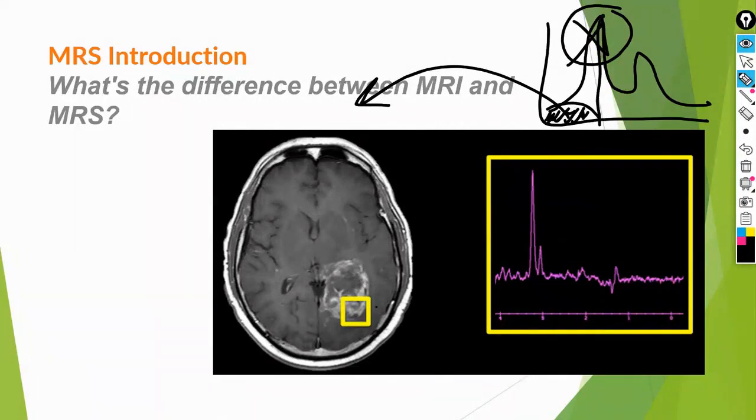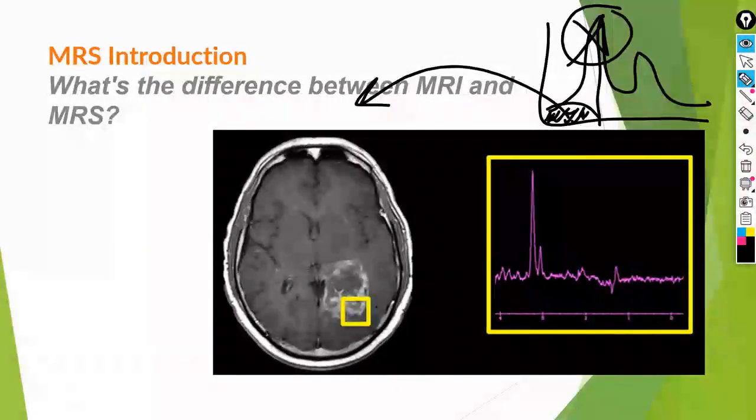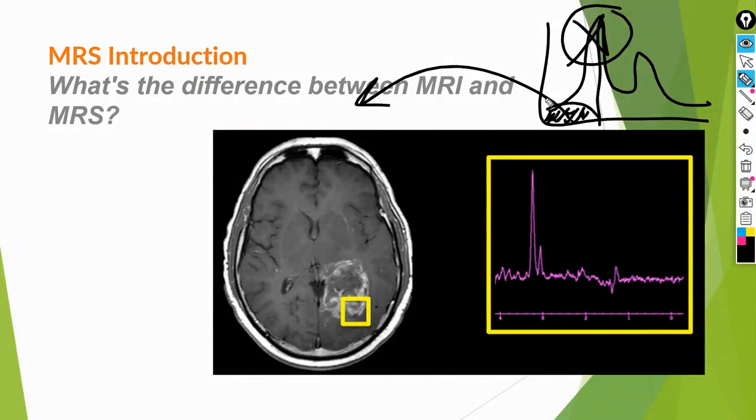What happens when I give it an RF pulse? Do you remember the saturation topic I was talking about? I said that I can give saturation, and this saturation will eliminate the hydrogen present in the water. In this case, I will start applying the sequence for MRI spectroscopy. Now, I will work on the metabolites, and this is very important. The spectrum will appear in this form. This spectrum always has a distinctive shape.